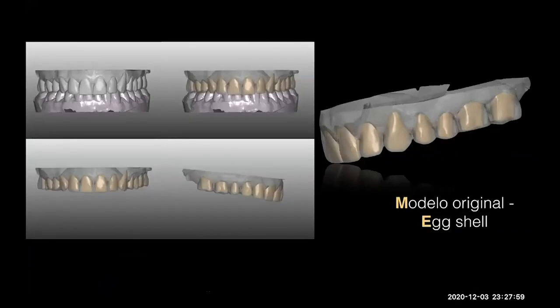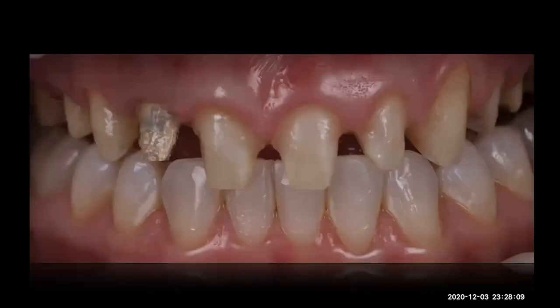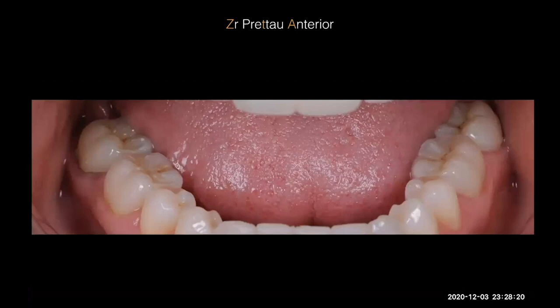And at the same time, with the same file, we developed the eggshell for the upper part. But the idea was to deliver first the lower crowns to organize the curve of Spee. Okay. That was our protocol: deliver first the lower crowns. We did zirconia crowns, stain and glaze, that, like I said before, is enough material to make nice and good restorations.